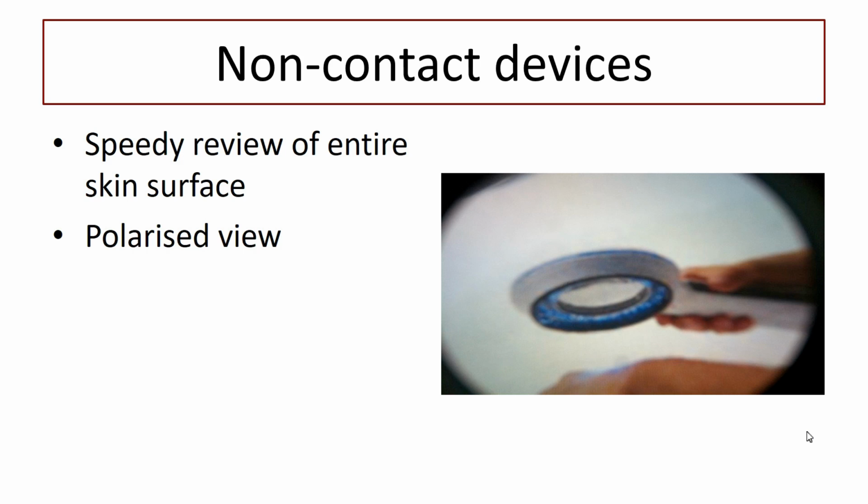An ordinary magnifying glass is not really enough. It doesn't act as a dermatoscope because it doesn't have that quality of reducing the reflection from the surface skin.